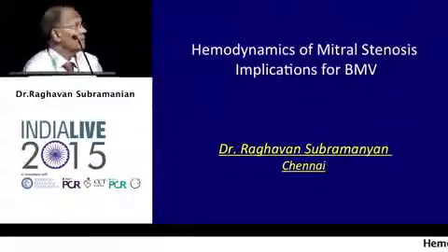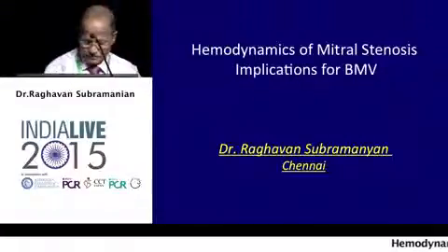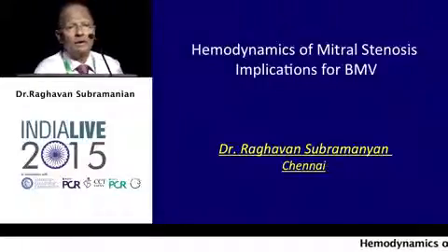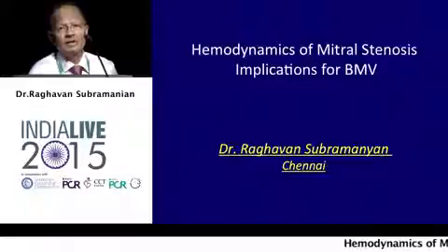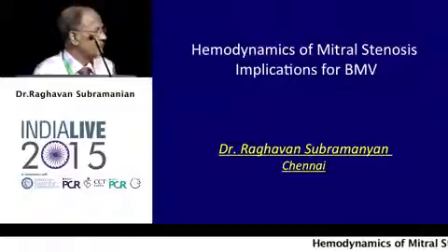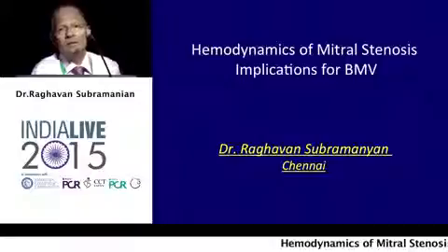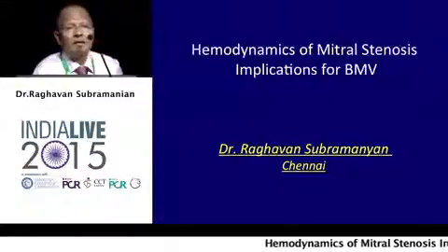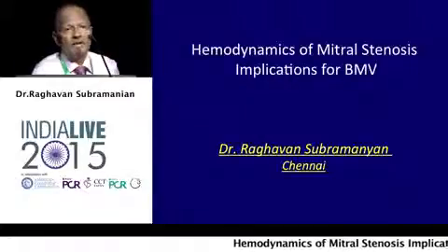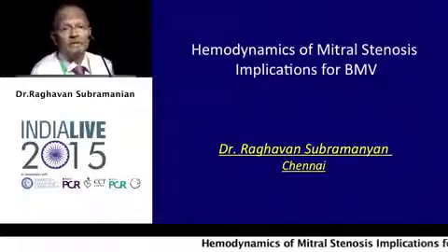My job is to talk on the hemodynamics of mitral stenosis, implications for balloon mitral valvotomy. The advent of 2D echo and Inouye method of balloon dilatation has really revolutionized the management of mitral stenosis. And therefore, many experts in this hall may be quite capable of performing BMV even without performing a detailed hemodynamic study. They could even do without measuring the gradient.